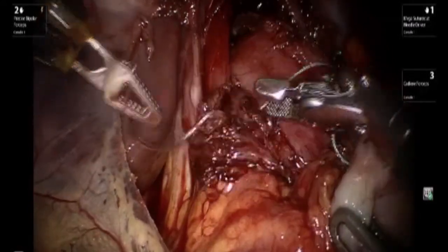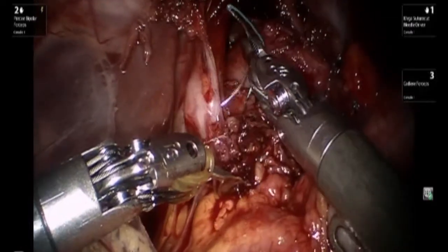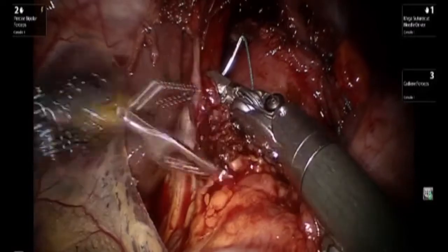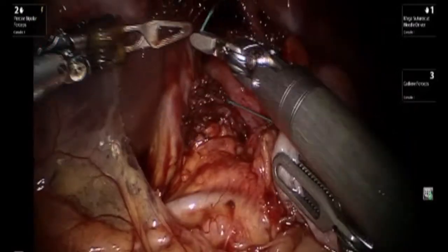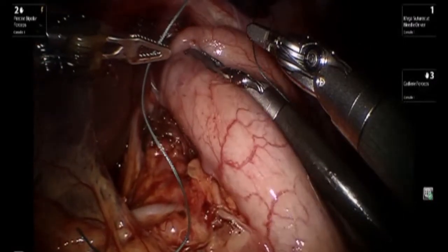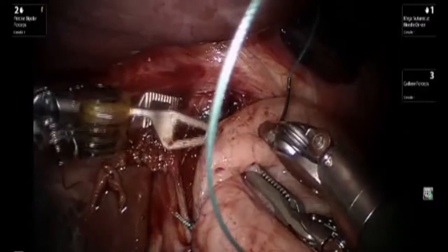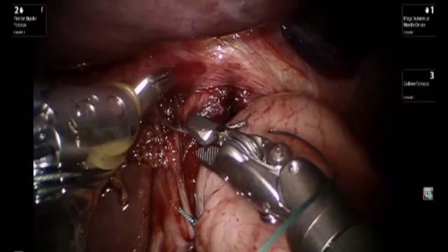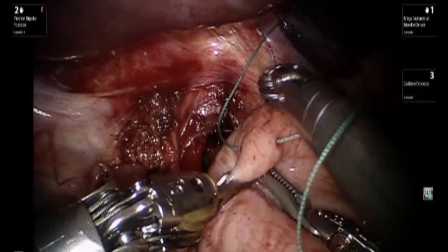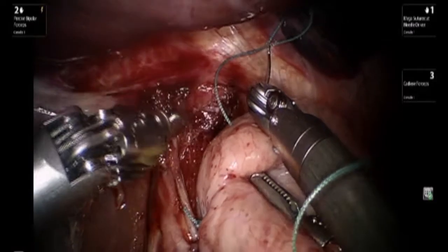The right side also incorporates a portion of the right crus in order to minimize the chance of this portion of the esophagus migrating into the posterior mediastinum. The stomach is fixed circumferentially along the area of the hiatus to completely close off the hiatal opening.